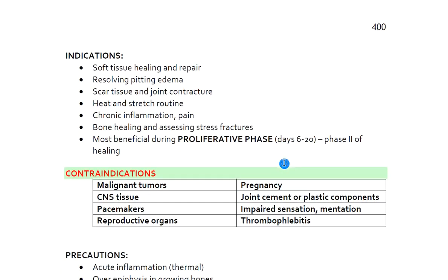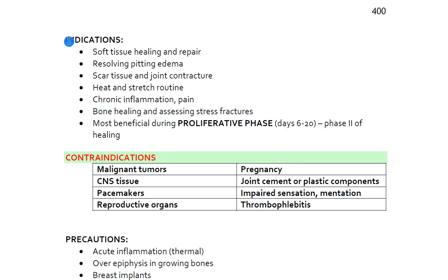So in terms of what the indications for ultrasound are, we're looking at anything where you want to increase healing. Is there some type of pitting edema where you want to bring more blood flow and circulation to the area? Is there scar tissue, so chronic tissue, that you want to break up a little bit? Often it's combined with stretching, and that's shown to be helpful. Is there some type of chronic inflammation that would benefit from increased blood flow to the area?